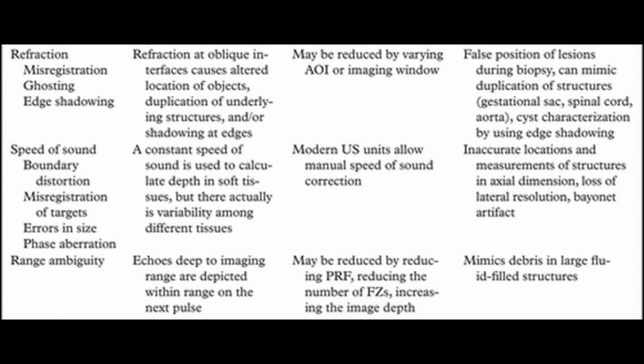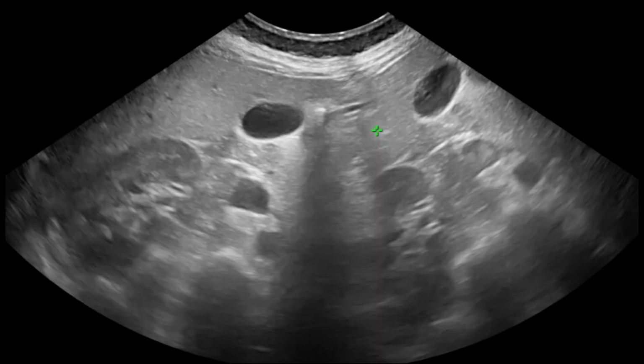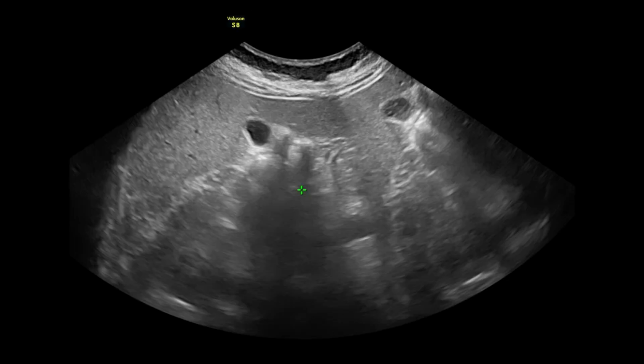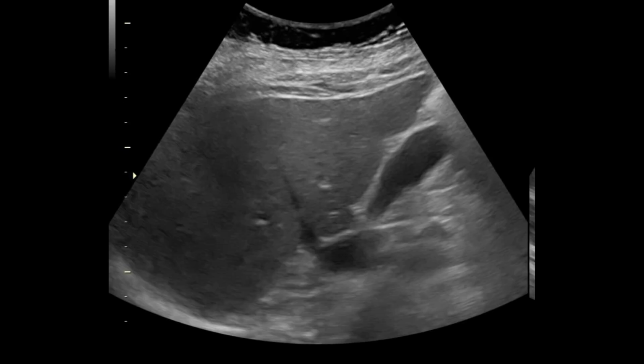One of the patients was lean enough, so I used the transvaginal probe to assess the abdomen. There were no artifacts with the transvaginal probe, so the problem was only with the curvilinear probe. I informed the application specialist that the probe was malfunctioning, and he said he would come the next morning. I then scanned my own abdomen and all the artifacts were still persistent. Next morning, one of my assistants gave a hint. Because of the fear factor the previous day, she didn't say it then. After that hint, everything got resolved.